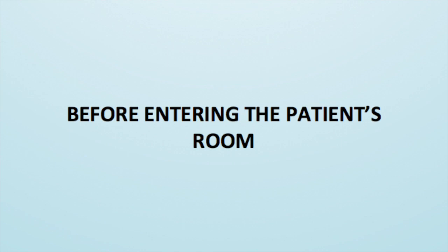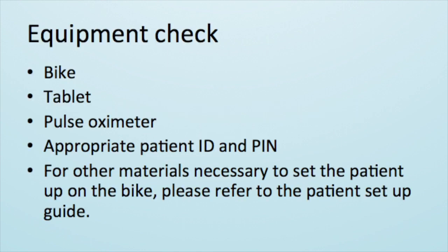Before entering the patient's room, please ensure you have the bike, tablet, pulse oximeter, and appropriate patient ID and PIN ready. For other materials necessary to set the patient up on the bike, please refer to the patient setup guide.